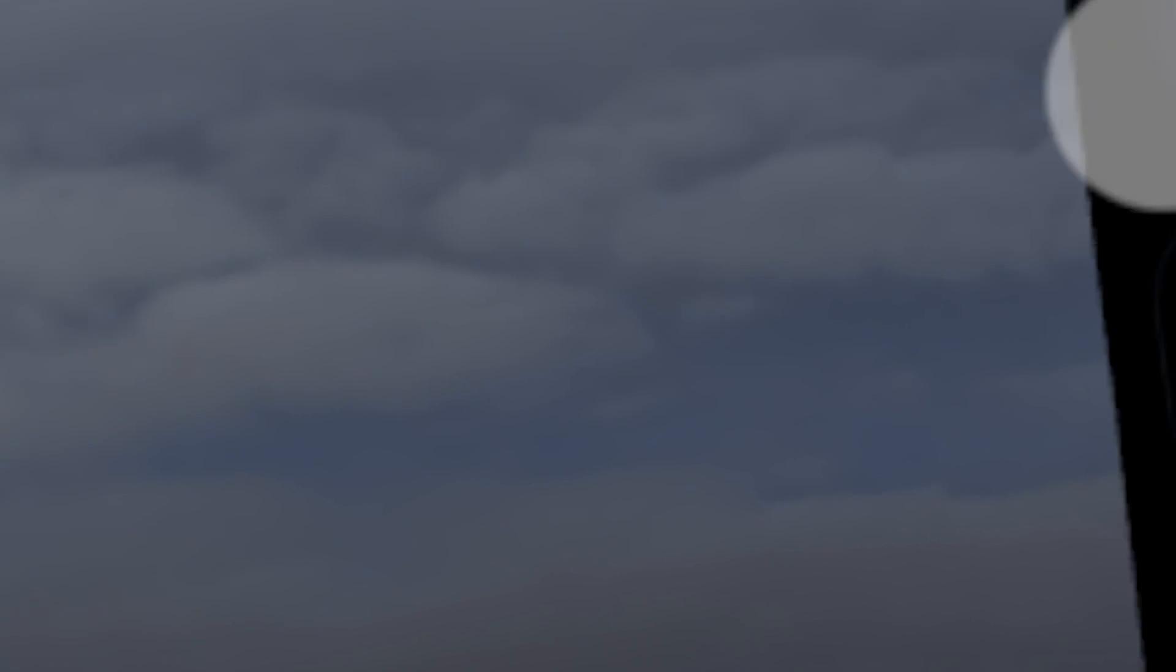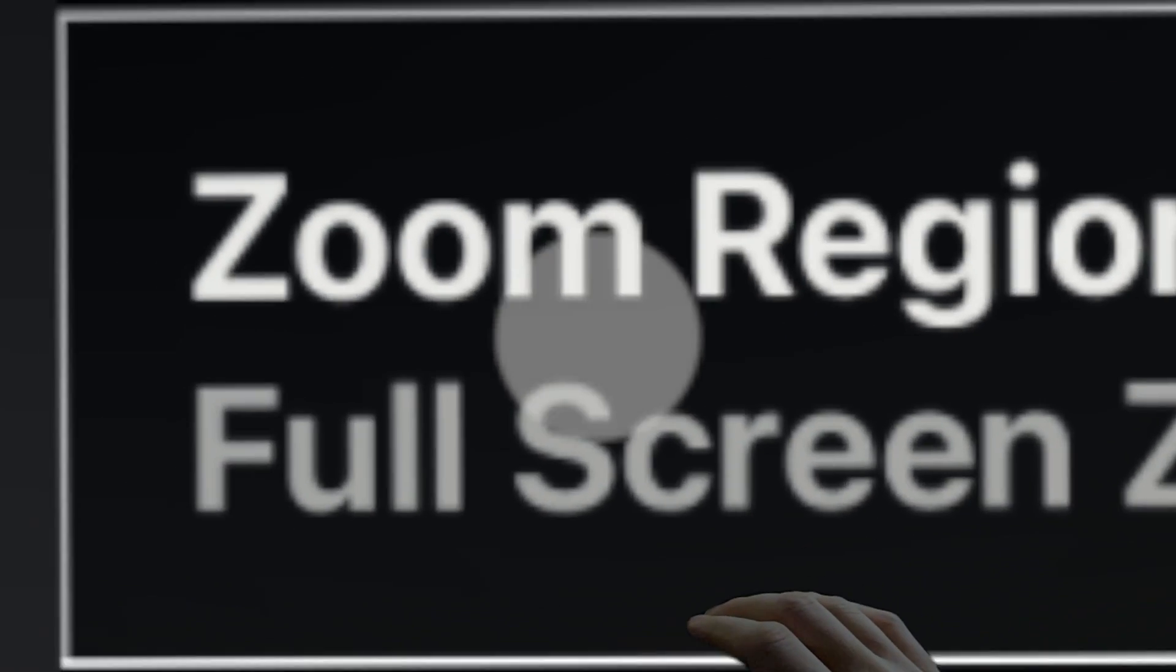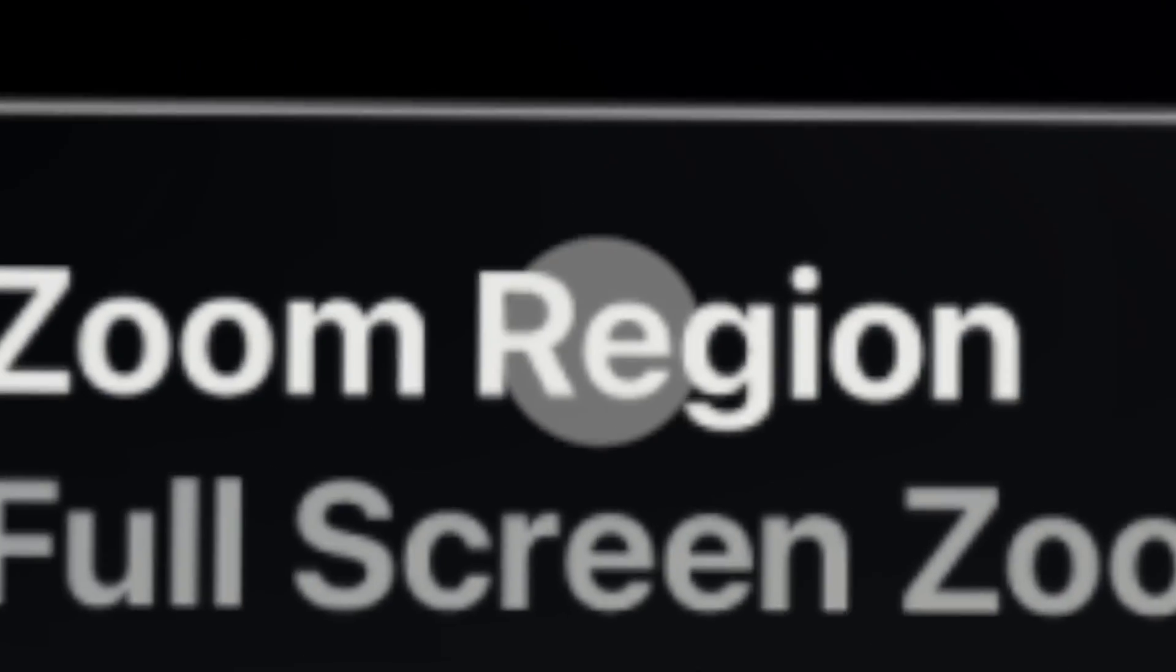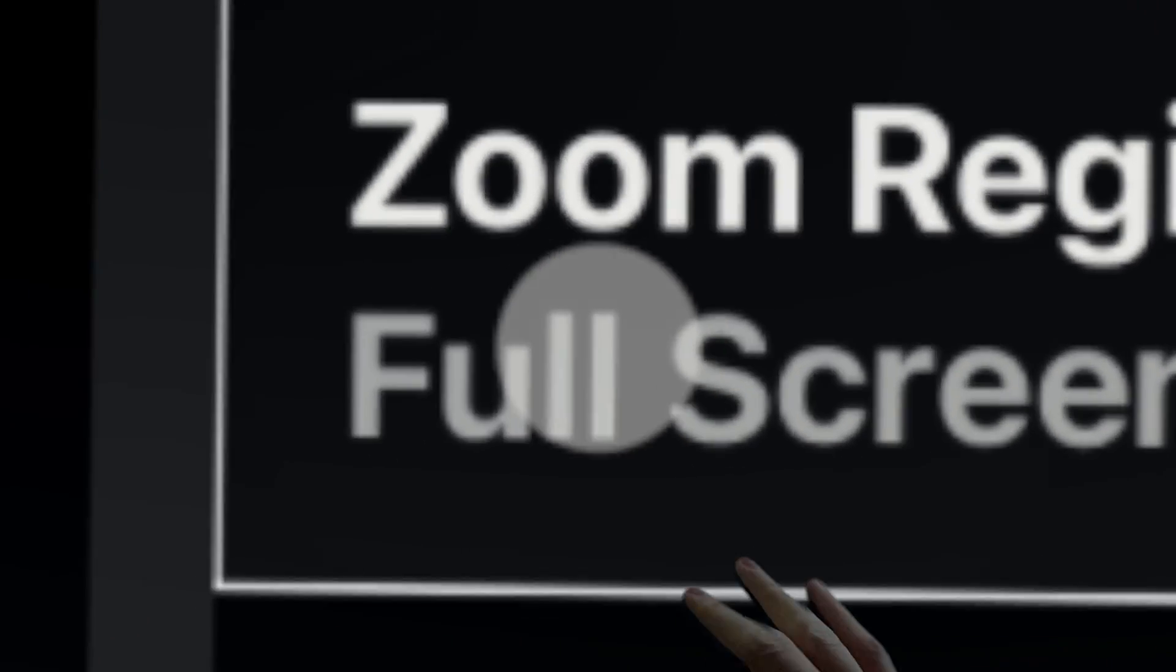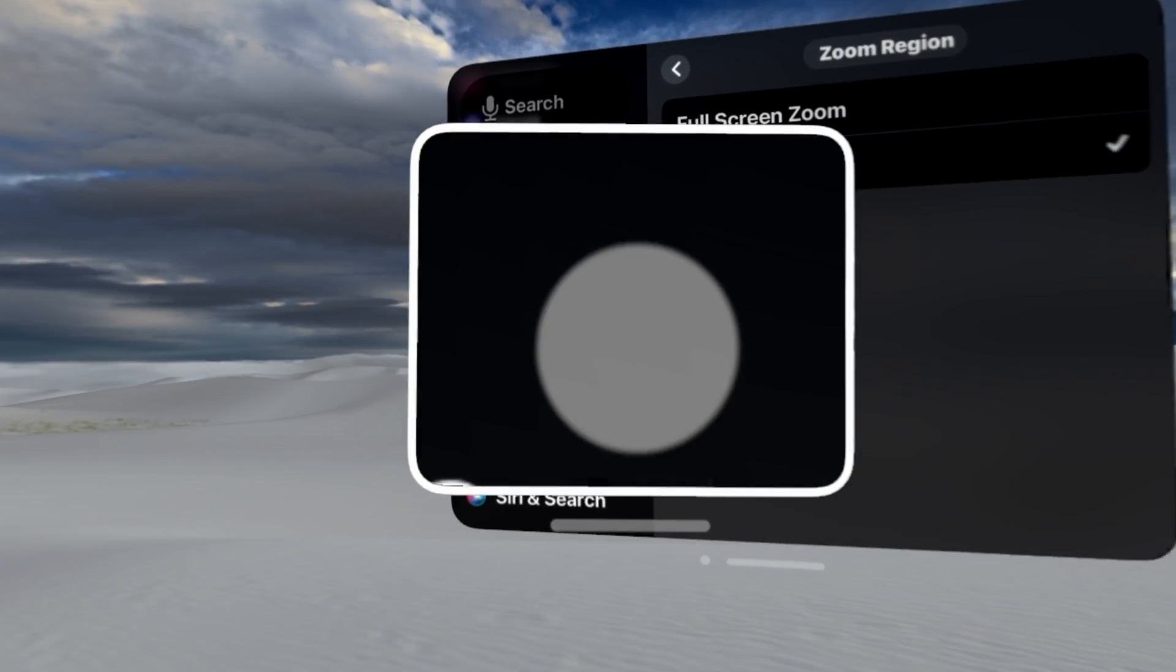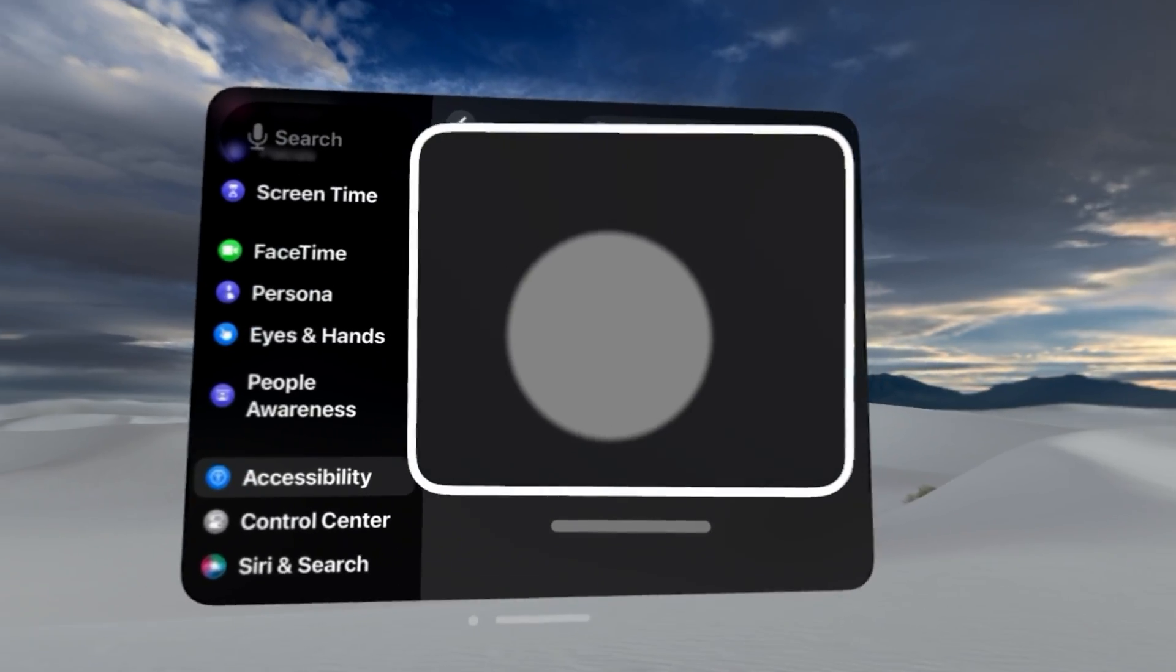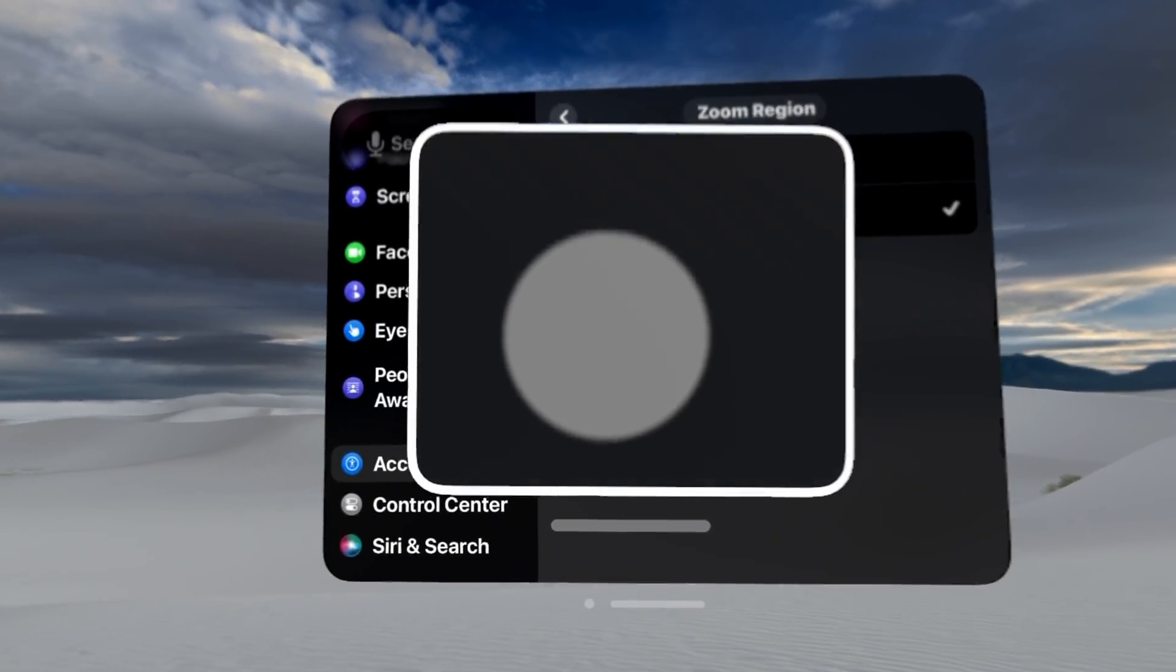You do have the zoom controller, you can turn that on if you want. The zoom region - I talked about that. You have lens or full screen. I'm utilizing full screen. So I'll demonstrate this just so you guys can see. This is the window zoom.